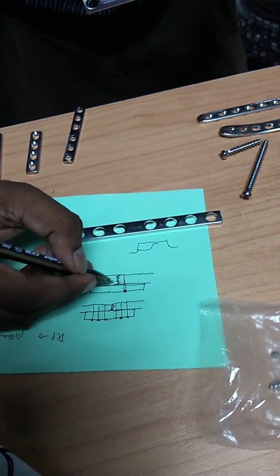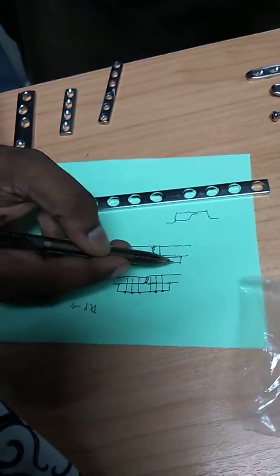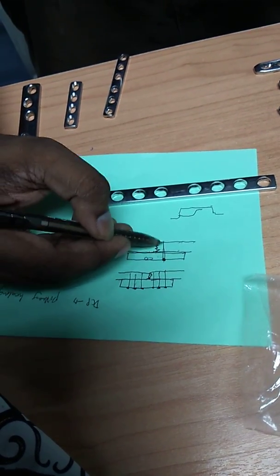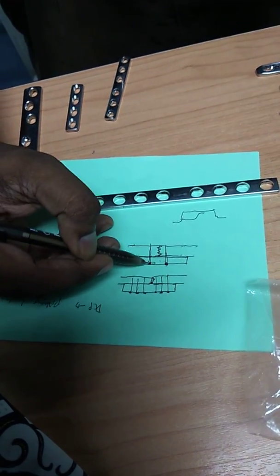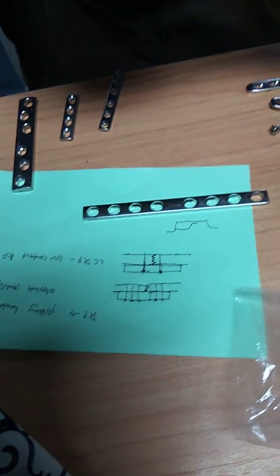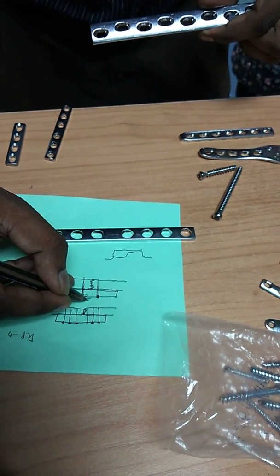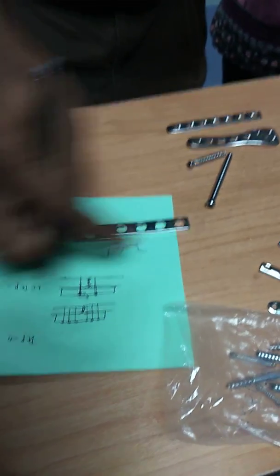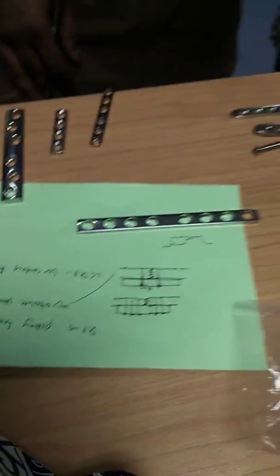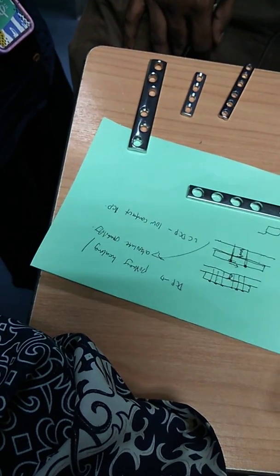The screws, once the plate is on top, we have to start adjacent to the fracture site first, and only then go beyond that. Once you place one screw already, the other screw you want to put in a compression hole. This one is in a neutral hole, this one is in a compression hole. Once you put it in a compression hole, because of the convexity here, the screw will push the plate towards the fracture site, therefore compressing the fracture site and promoting absolute stability, the primary healing of the bone. Understand? Any questions so far?